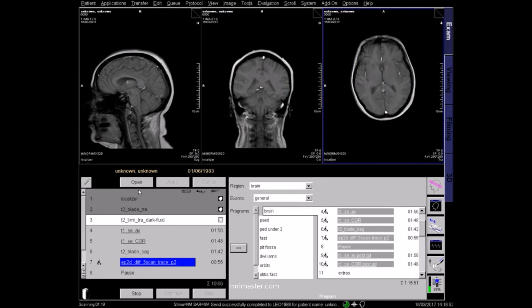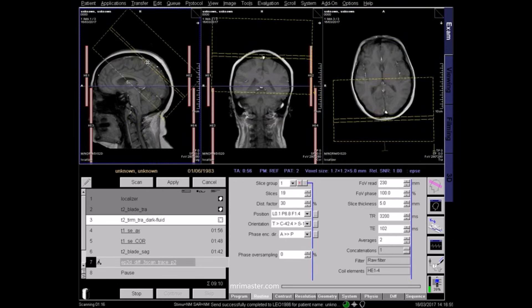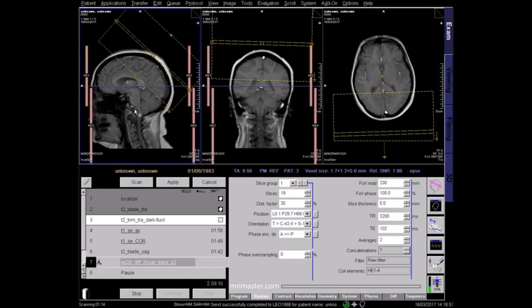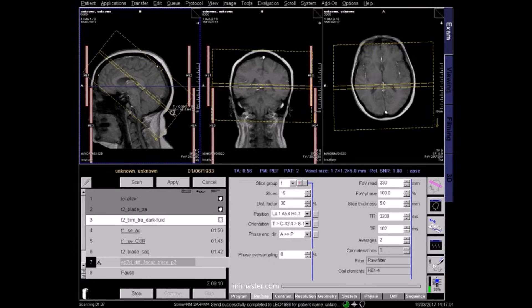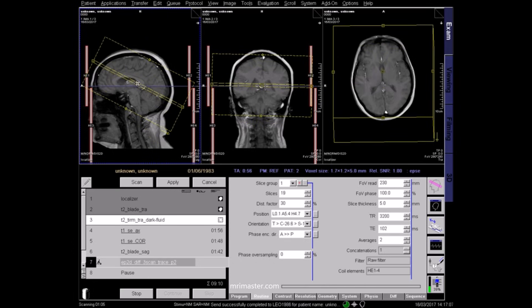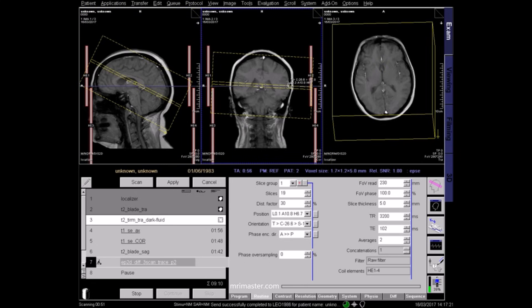The diffusion axial slices are planned parallel to a line from the glabella to the foramen magnum. This reduces artefact at the border between the paranasal sinuses, which contain air, and the denser bones of the skull base. Be sure to cover the whole brain from vertex to foramen magnum, and center to the midline in coronal and axial views.